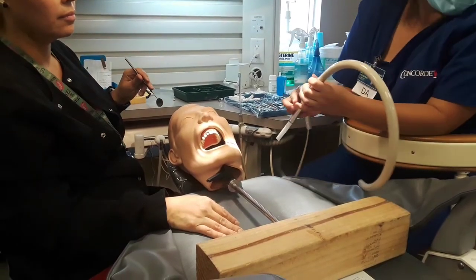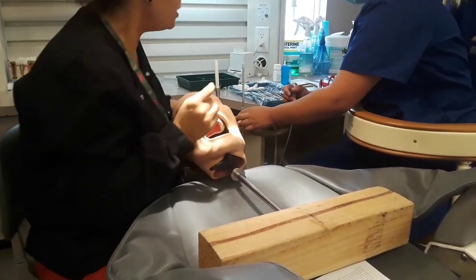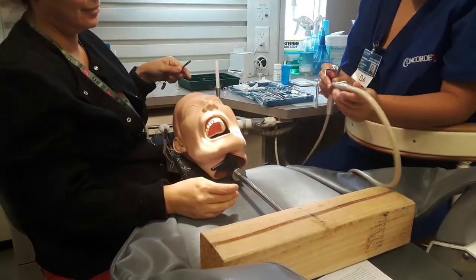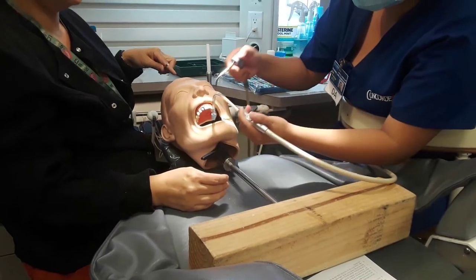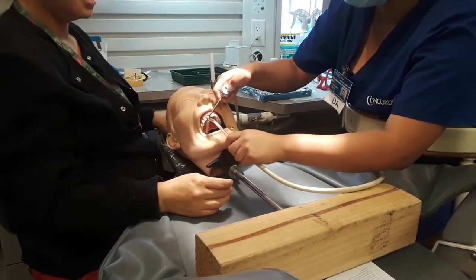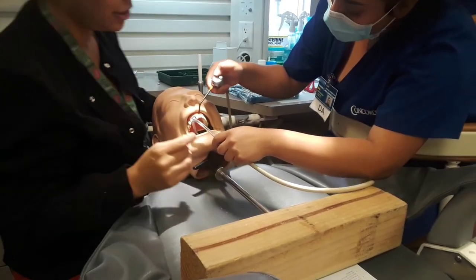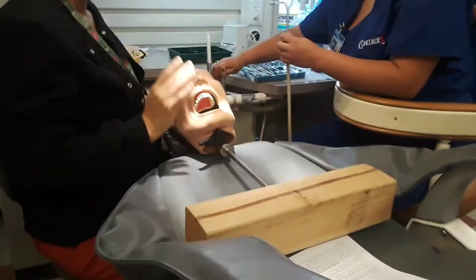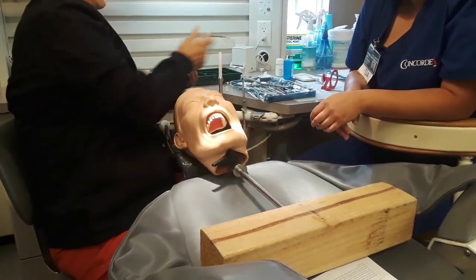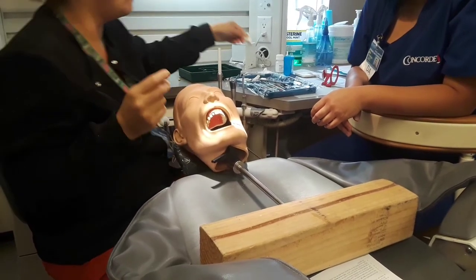Should we be in there with the suction? No — because what if you suction that crown? That's a permanent crown. You could do the saliva ejector. If your patient is sensitive, here's another trick: spray some gauze and you're just going to wipe it instead, because your patient could be super sensitive to the water.